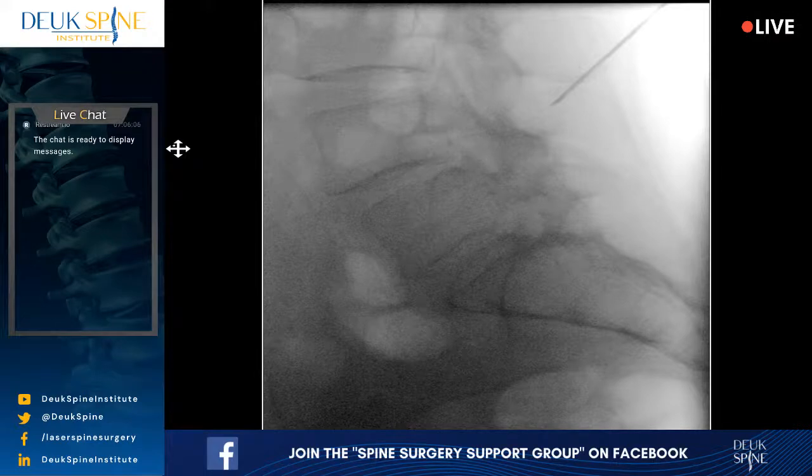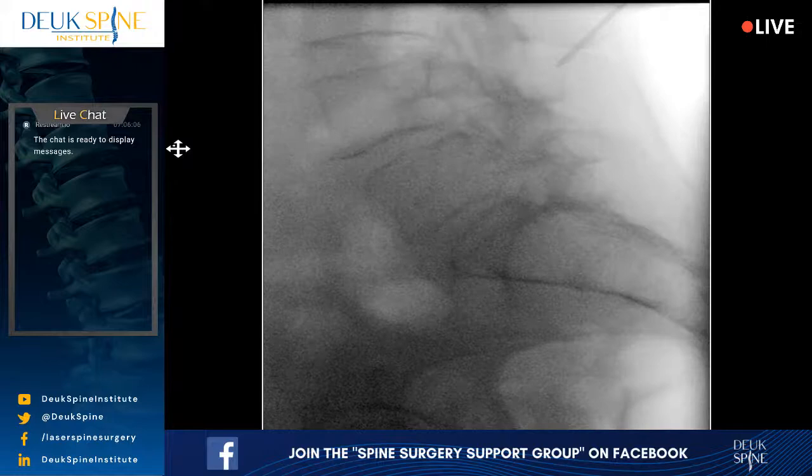And if you move your hand just so slightly, like literally a degree or less than a degree to one side or the other of the star, your laser is not gonna hit the star. Okay, so the further the distance from the origin to the destination, the more accurate or precise you really need to be with your trajectory.